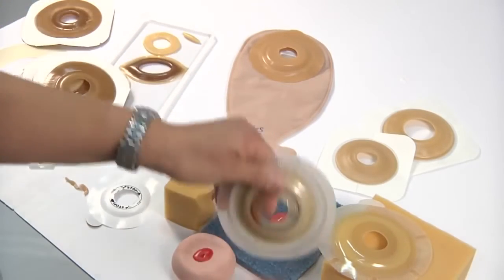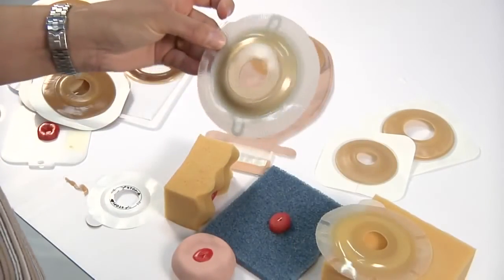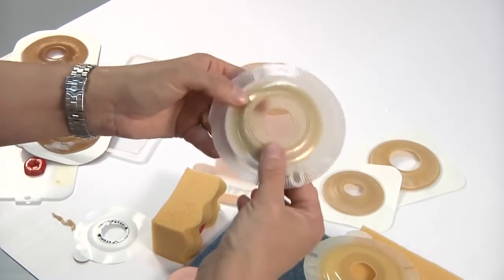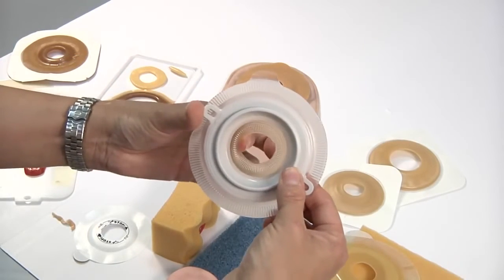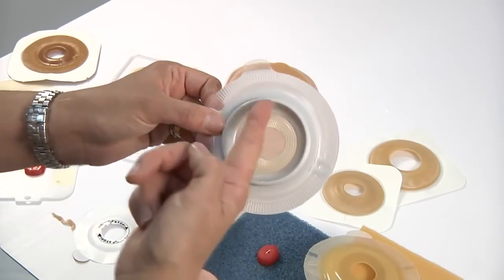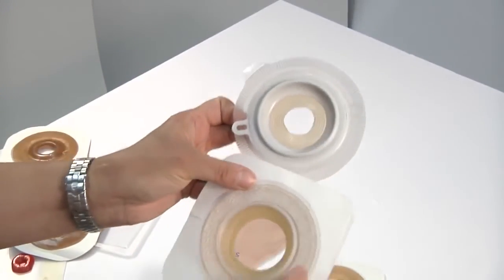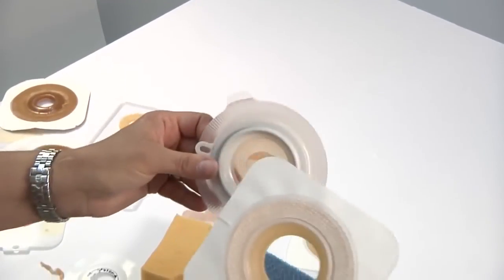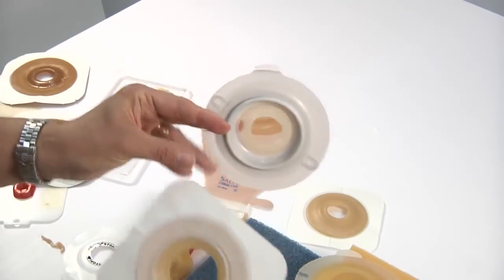And again, when you're assessing the rigidity and you want to see how firm it is, you should always take the release liner off the back. That gives you a better idea. You've actually got a fair amount of flexibility there as well. So your tension's going to be on the outside and not so much on the inside on these cut to fit ones. So if you need to have this dish or bowl inside of the coupling mechanism to give you your rigidity, then you're probably looking for a pre-cut appliance rather than these cut to fit ones.